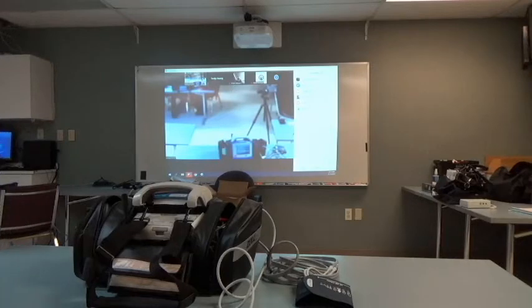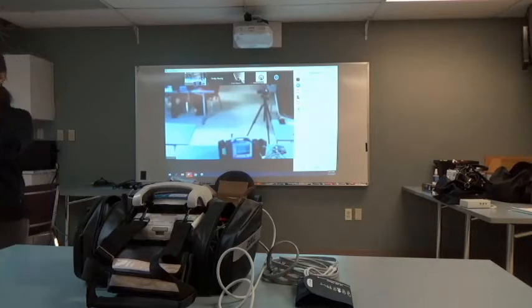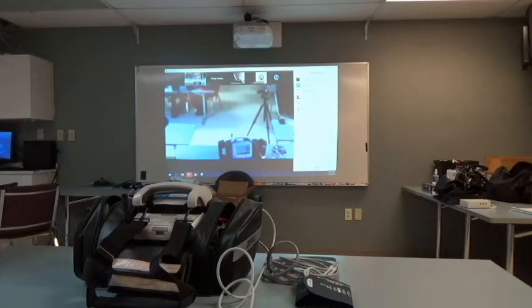The next thing we're going to do is put age and gender in. So that second button pushed down, which is that little clipboard on the left-hand side, is going to pull up age and gender. You can change that using your navigation keys. My understanding is you have to put a name in. For the sake of time, please only put a first name in, and I want to show you a shortcut. So before you start, hang on just a second.